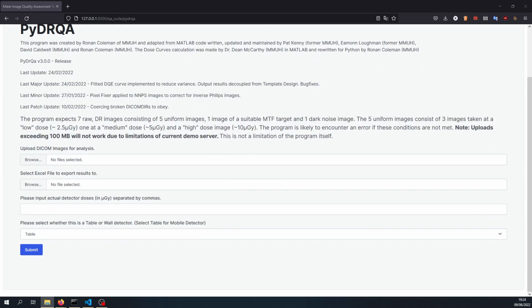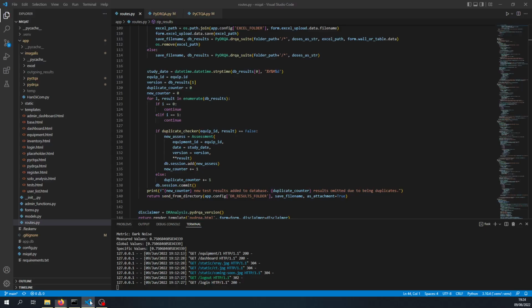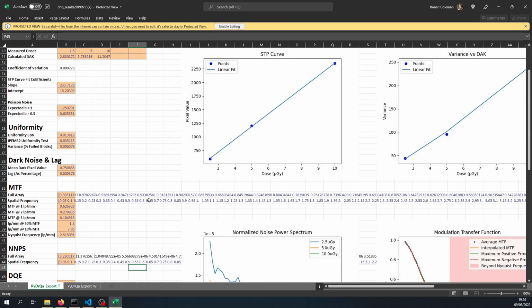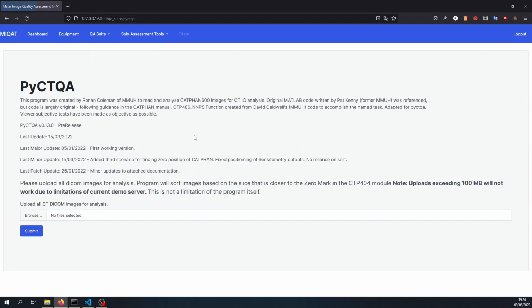So I'll quickly run through the DRQA tests, and as you can see from this form, it's very usable. It's just like navigating any other web app or website. For this, I'm just going to add my 7 files for DR image analysis. For my low, medium, and high dose, I have 2.5, 5, and 10. I'm not going to add an Excel file, so we'll just export it to a regular blank template, and I'll click Submit. You can see up here, it's loading, and if we have a quick look in the console window, oh, it's finished. We have our time for execution. And up here in the downloads, we can see our DRQA results. Fantastic.